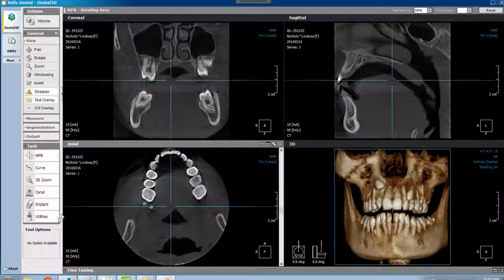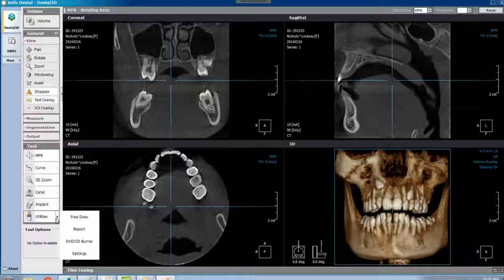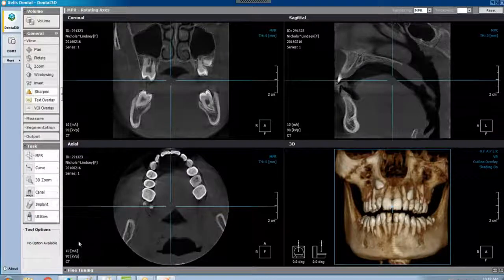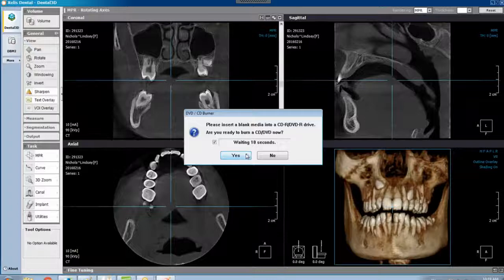Then you're going to come to utilities, it's the last task on the left hand side. You're going to hit DVD CD Burner and go ahead and say yes.